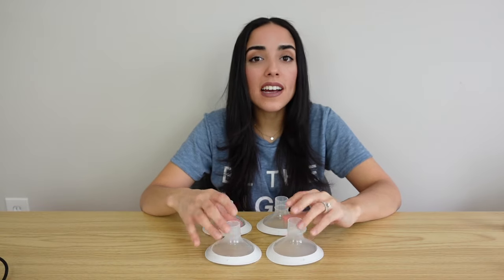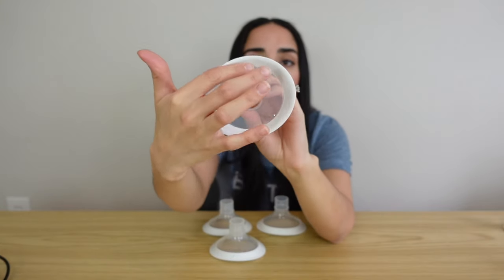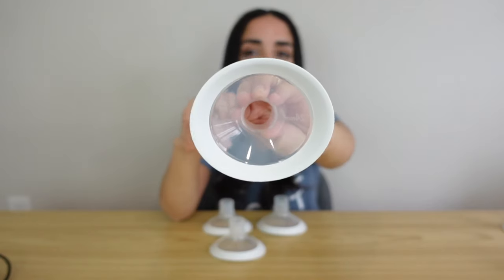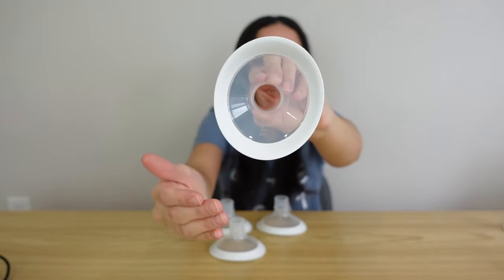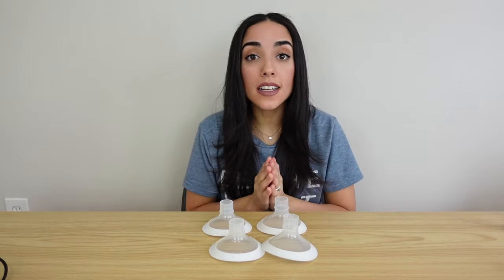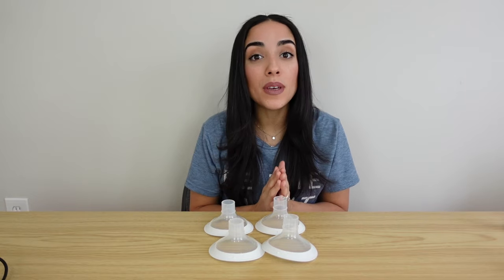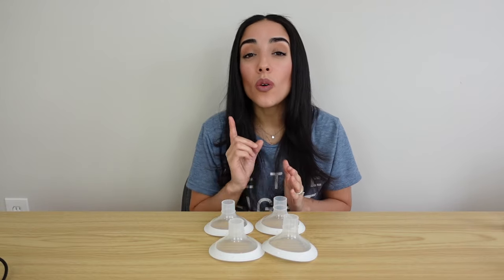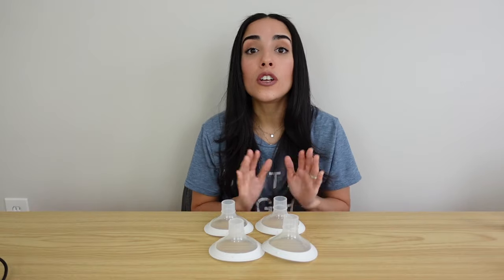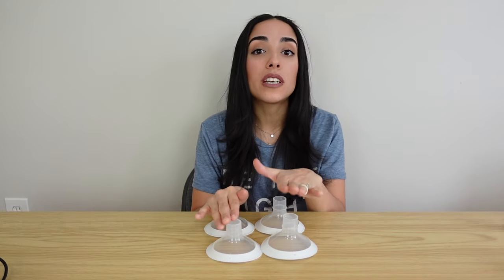The flanges that come with this pump are called their PersonalFit Flex flanges. What I really love about these is that they have a soft rim around the edge and they're oval shaped for more comfort. You can wear them either horizontally or vertically depending on what's most comfortable for you. Even though the pump comes with four flanges, one size doesn't necessarily fit all. In my personal experience, the 21 millimeter and 24 millimeter flanges didn't fit me.